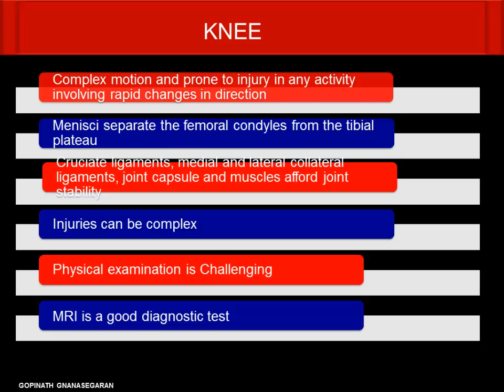In fact, it's not widely used. And currently, the role of nuclear medicine in patients with knee pain is only post-operative. Once they have a prosthesis, then the question is about whether it's infection or loosening. That's where we play a major role. But in our department, even in pre-operative knee pain, we use SPECT CT as one of the investigative modalities.